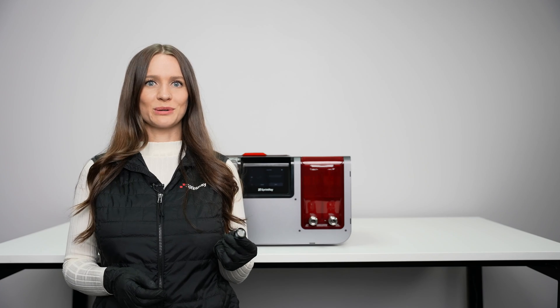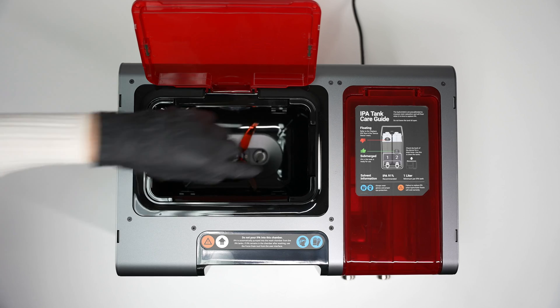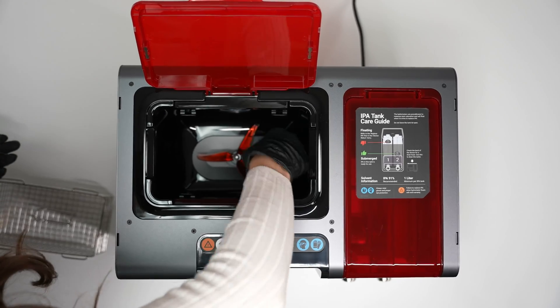This mesh filter protects the plumbing from debris. When the screen prompts you, unscrew it, run it under cold water to remove debris, and then place it back in.